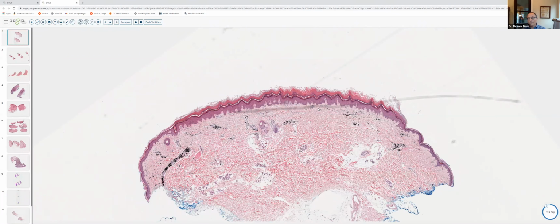As you know, sometimes patients with sun-damaged skin or very weathered skin heal extremely well. And if, say, a photograph wasn't taken or the orientation or site are not real clear or the patient can't remember, it can be very, very difficult. And at least once or twice a year, I'll have to have the very uncomfortable discussion with the clinician, calling them and saying, hey, I've leveled the section, I've looked at multiple sections, and I can't see the biopsy site. Are you sure that you did the re-excision at the right site?